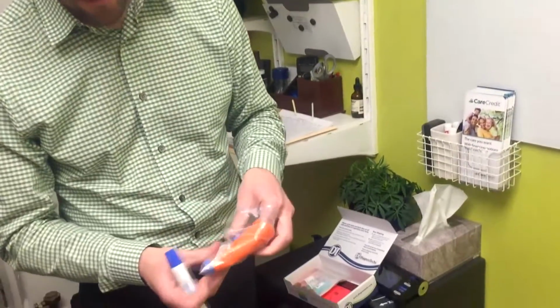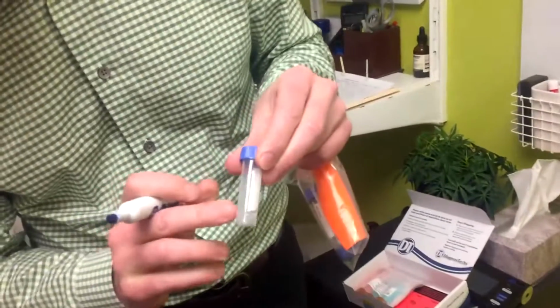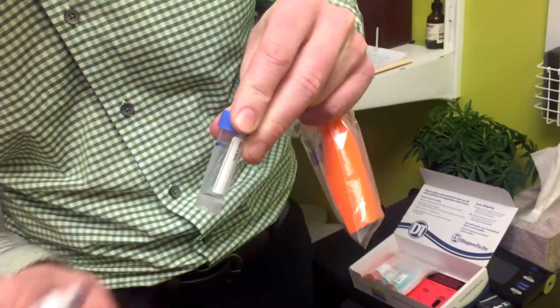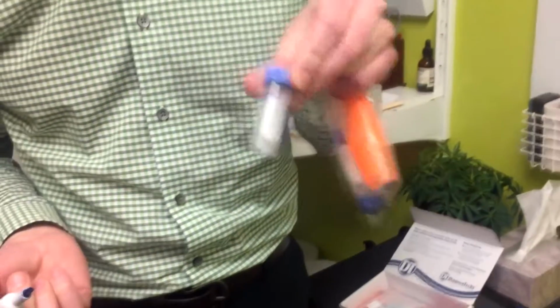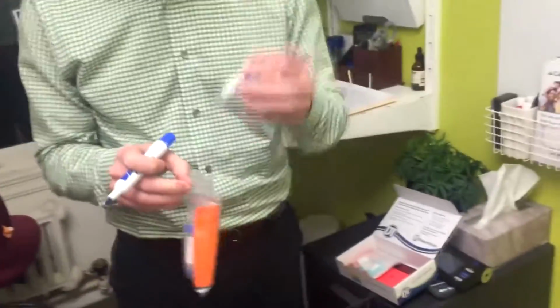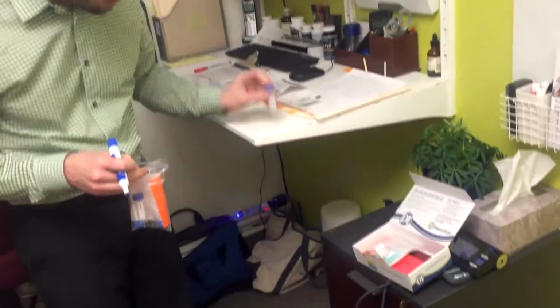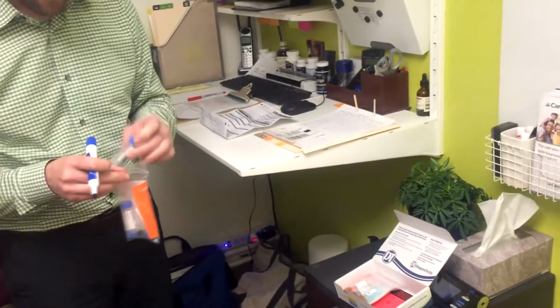And the amount of saliva you have to collect in each one, there's a little line indicator here, and you have to fill it up to the 5, which is that top line right there, with lots of saliva. And it needs to be liquid saliva, not bubbly saliva. So if it's looking kind of foamy in there, make sure you tap it down and knock some of the bubbles down.